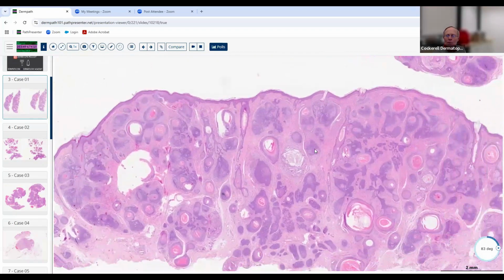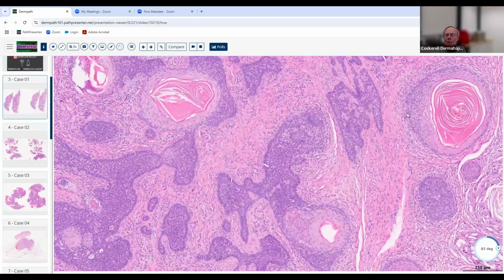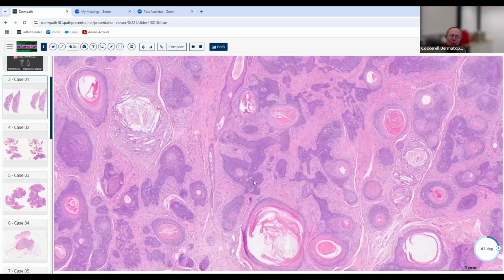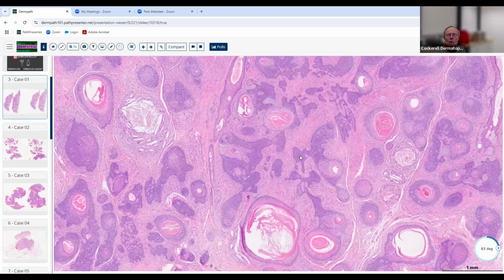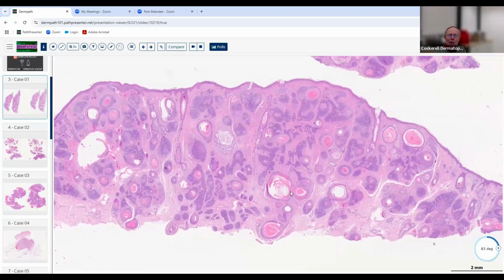And then we've got a very prominent fibrous stroma with no clefting between the epithelial components and the stroma. You see the clefting is occurring within the stroma itself. And so when we can tell what kind of follicular structures are present like this, and they look like little mini follicles like this over a diffuse nodular structure like we see here, that's pretty much diagnostic of a trichoepithelioma. So this is a classic example of a trichoepithelioma. It doesn't really look much like a basal cell carcinoma in this lesion. Sometimes they can, but in this situation, no.